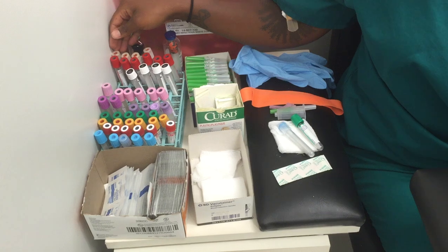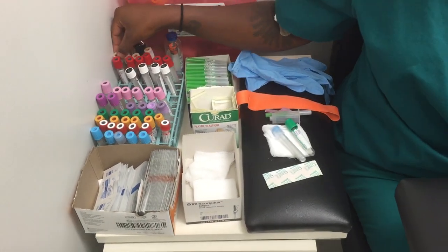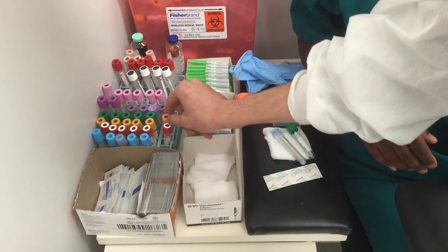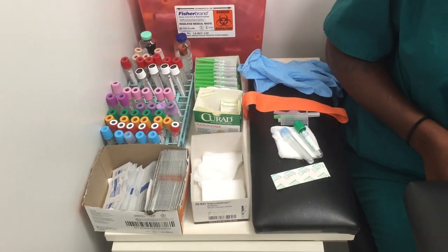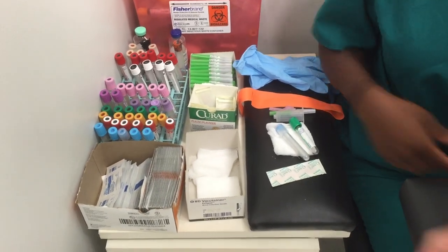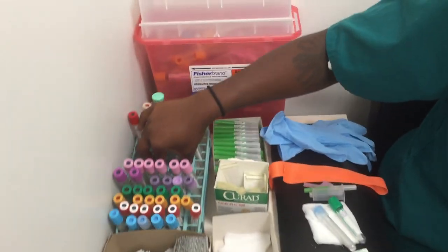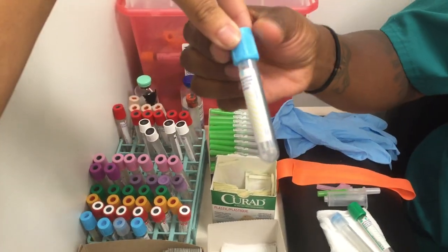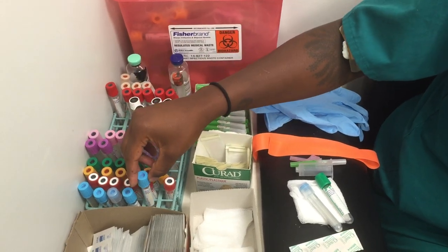Next we have white tubes and yellow tubes. Usually there are no additives in the white ones. Next, in the order of draw, we will show you what tubes would be in your tube rack. This right here would be a light blue tube. It would have sodium citrate in it and it is going to coagulation.